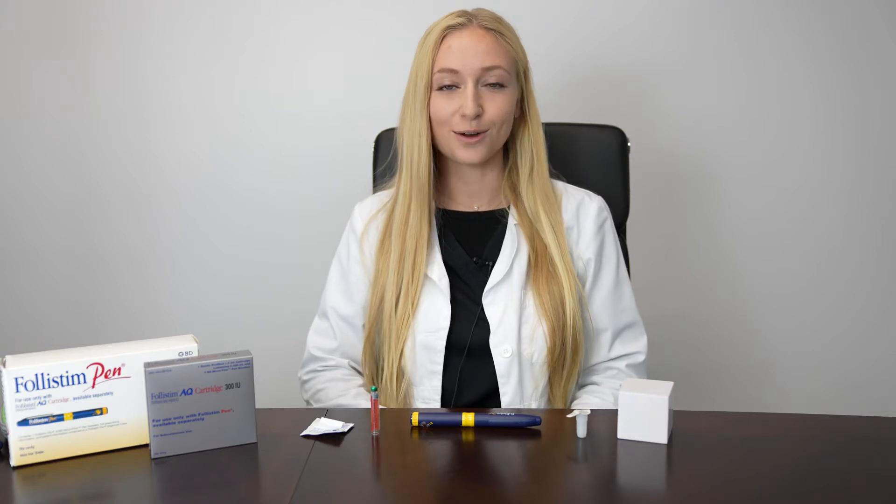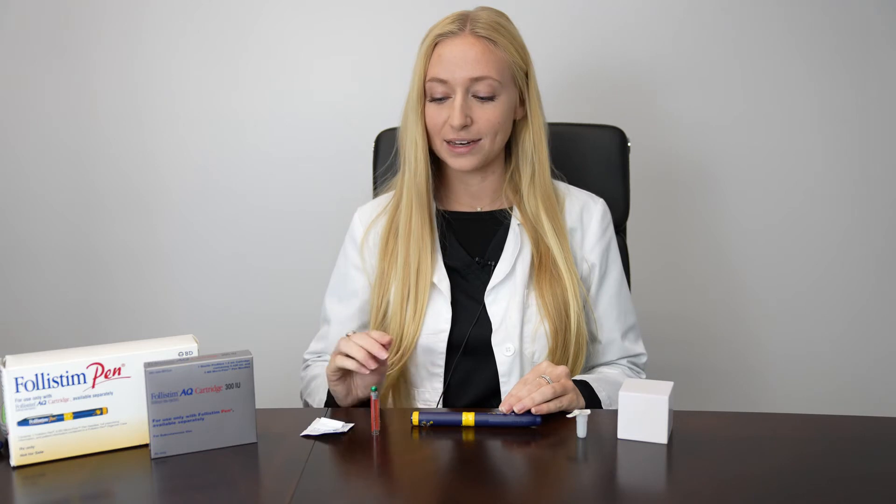Hi, this is Katie from Newport Fertility Center CCRM Orange County, and this is an instructional video on preparing and injecting Follistim. You'll have your Follistim pen and your Follistim cartridge with the medication in it. The medication should be stored in the refrigerator at all times.